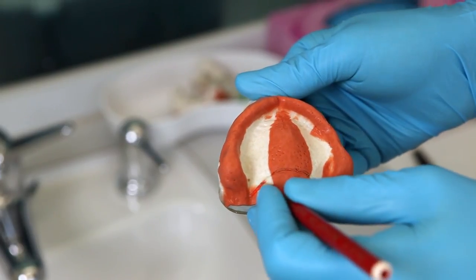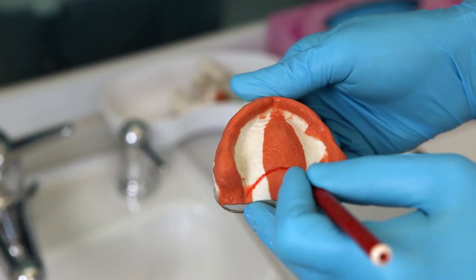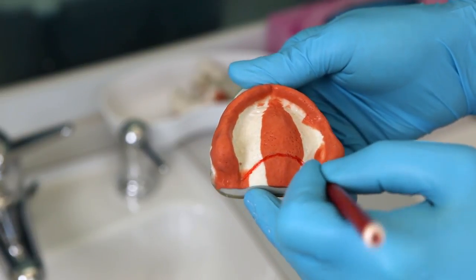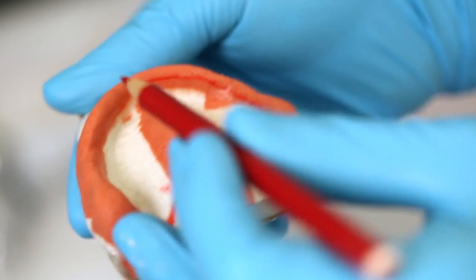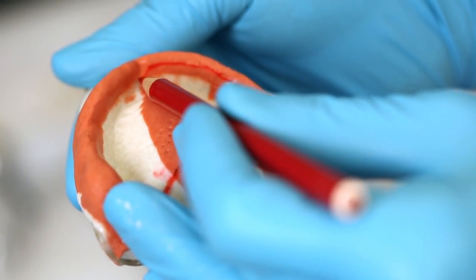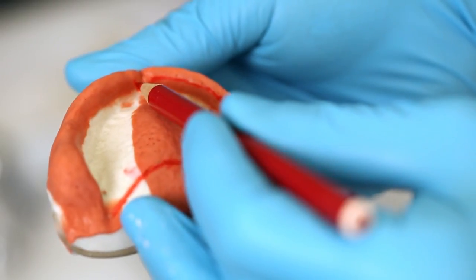These impressions are overextended. For example, the extension of the individual trays should be three millimeters shorter than the lowest part of the vestibulum. Additionally, the extension should roughly correspond with the indicated red marking.